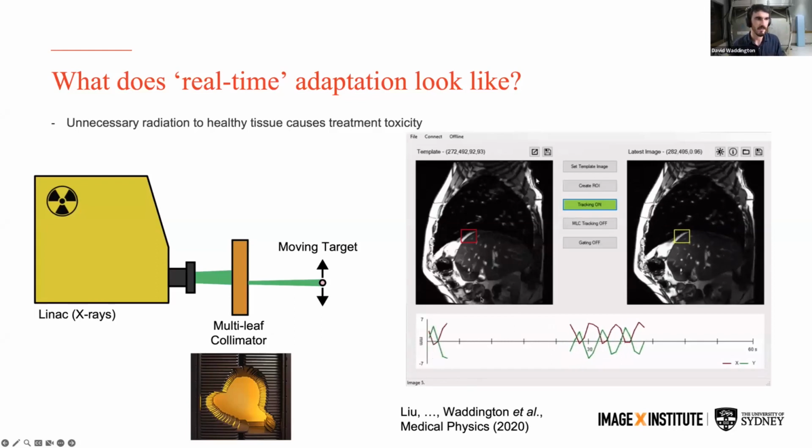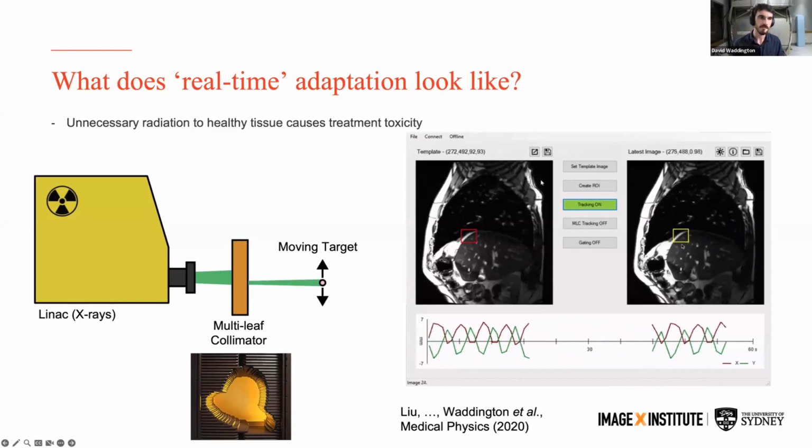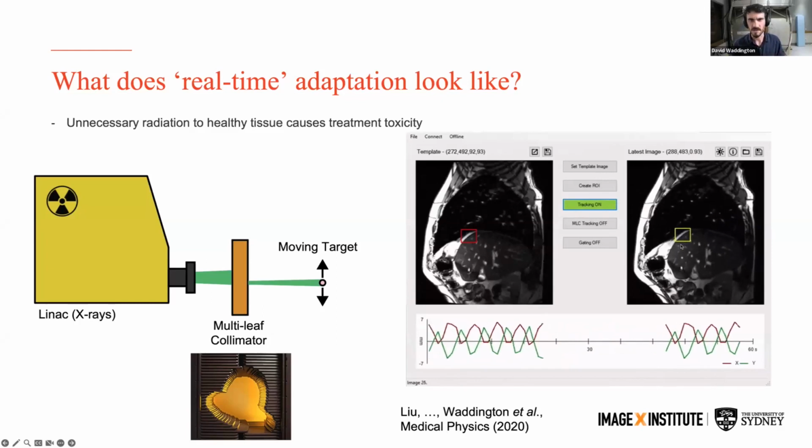In practice, the way we implement this on our system is we designate a region of interest, and then we use a tracking algorithm to track that movement, through template matching in this case.